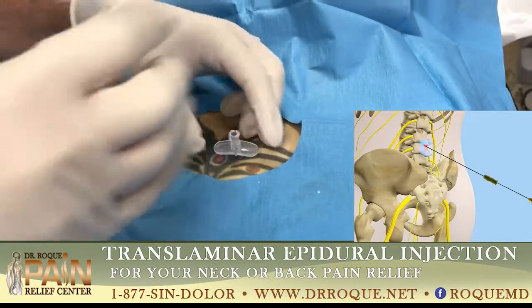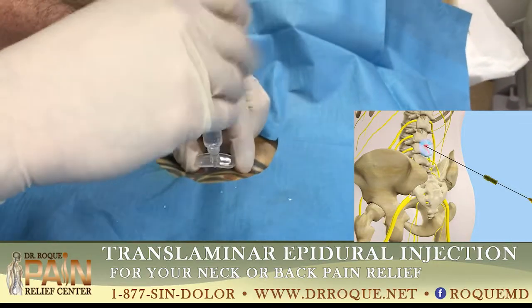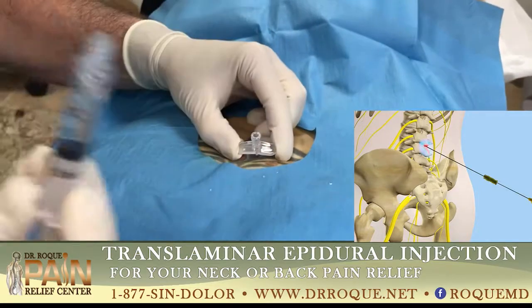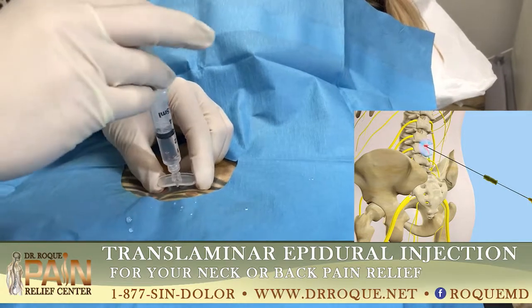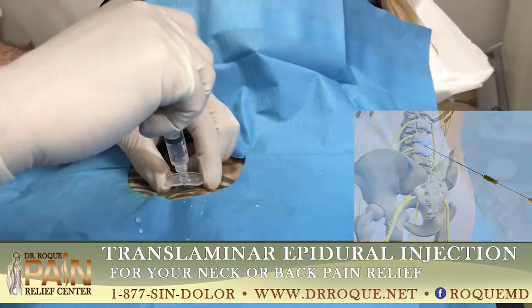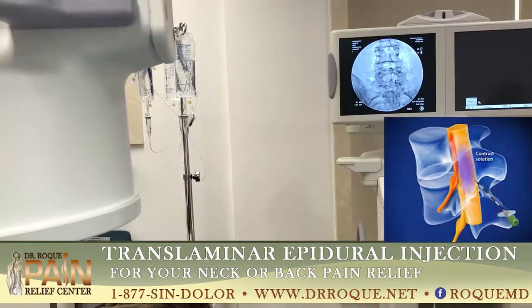So this is the contrast — you want to aspirate. You can actually see some of the CSF a little bit. So you aspirate, and then you push the contrast in. You're going to see a nice view, you're going to see something really nice now.